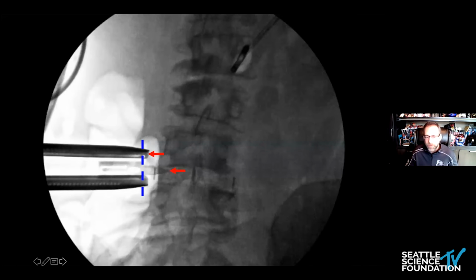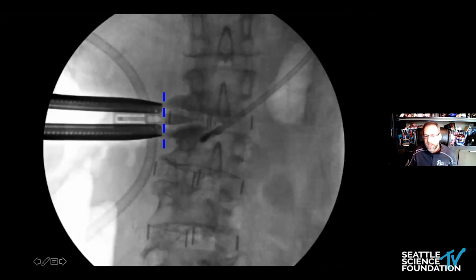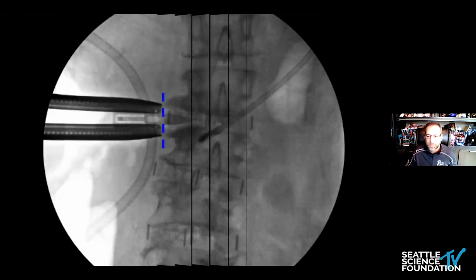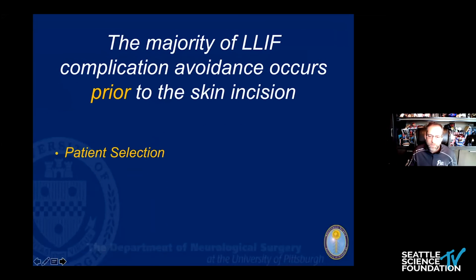And I think that's going to be even more important as Dr. Uribe is going to be showing us the single position prone lateral. When you're performing the procedure, make sure that your retractor is against your osteophytes and that it stays against your osteophytes. Sometimes apply that downward pressure. So important tip there. Also, don't overexpand your retractors themselves. What's sitting right in front of that retractor, if you mash it up against it, your segmental artery, you can end up with a significant vascular injury.